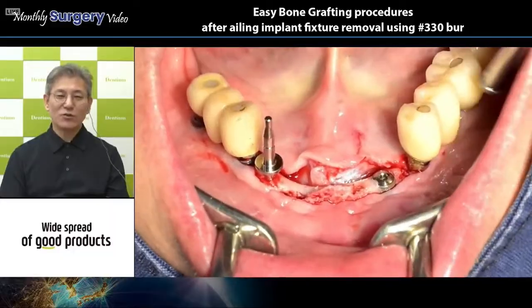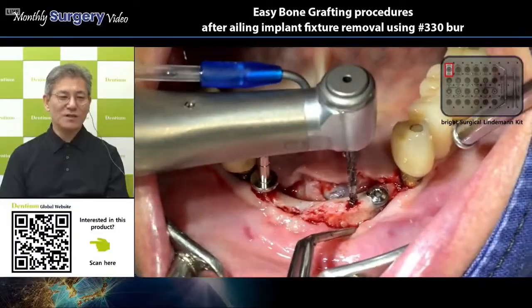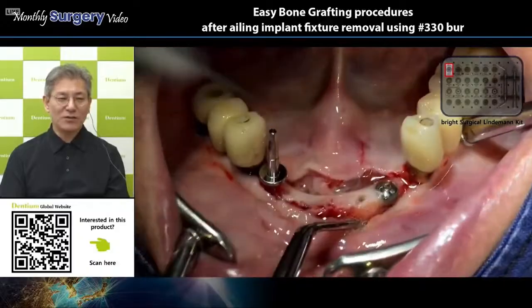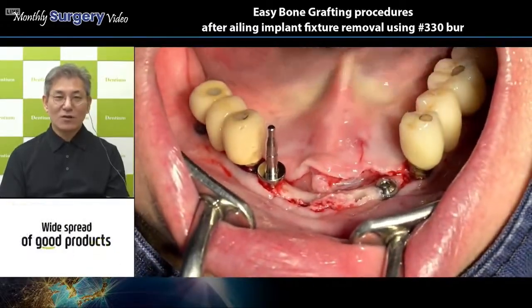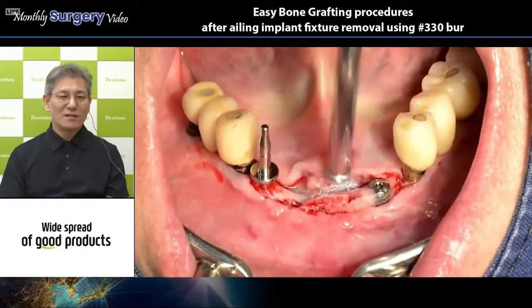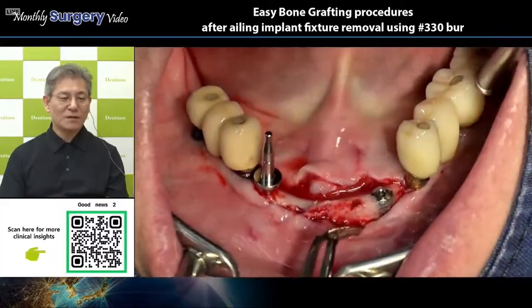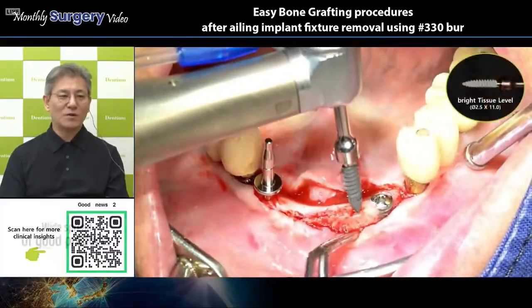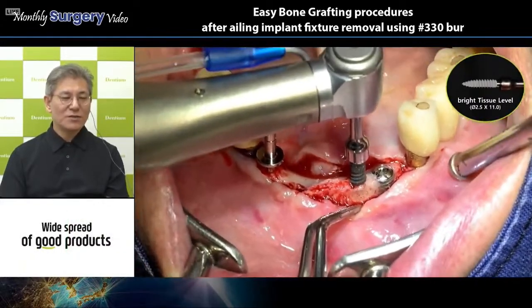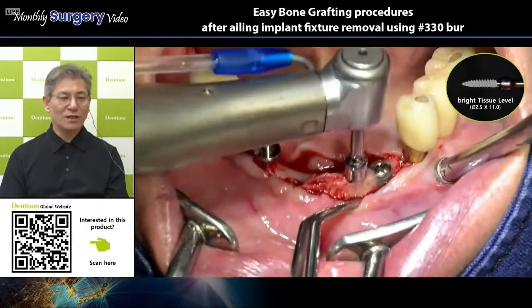I think due to numerous experience in implant surgery, even though it is the freehand, manual type osteotomy, it is very similar to using a surgical stent. However, for beginners or general dentists, using a surgical guide is sometimes helpful to make proper positioning on this narrow ridge.